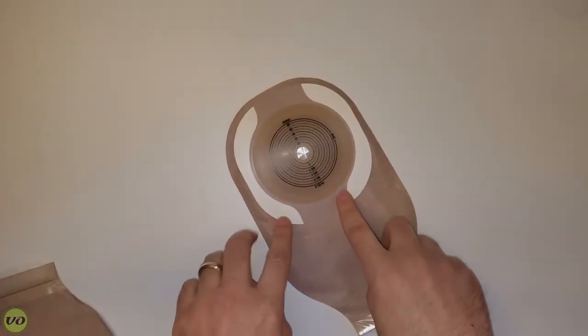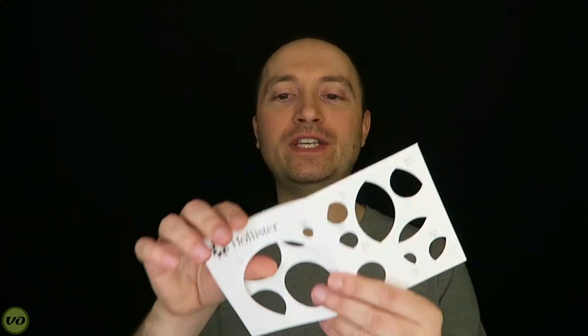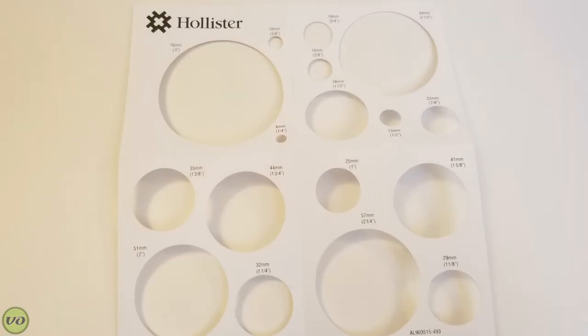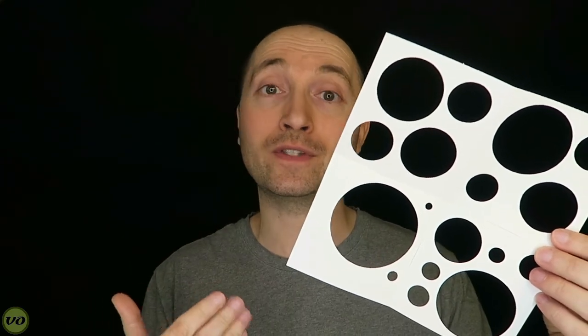I'm really happy to see that Hollister includes a cutting guide on the stoma and also includes a stoma measuring guide in the box — though the one they include is paper, which isn't the best choice. You get one in every box, and it has all the regular size stomas, though it doesn't have anything for oval-shaped stomas or other measuring tools I've seen with other brands. Hollister also includes disposal bags in their boxes, which I find a little small but convenient nonetheless.